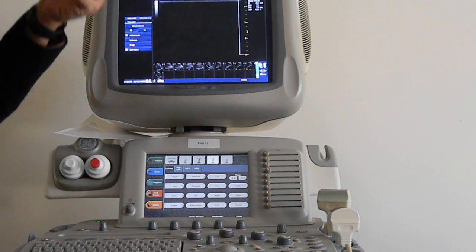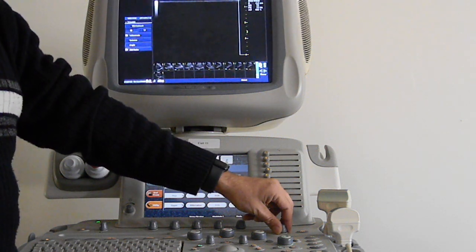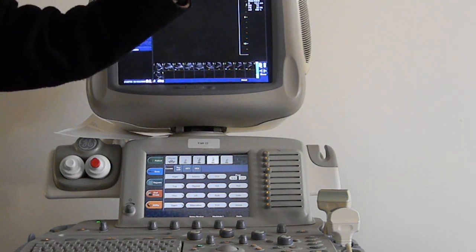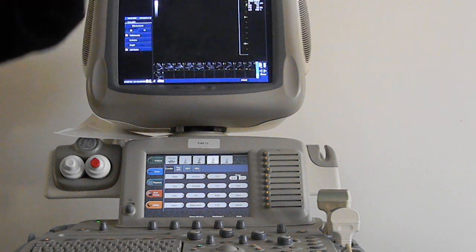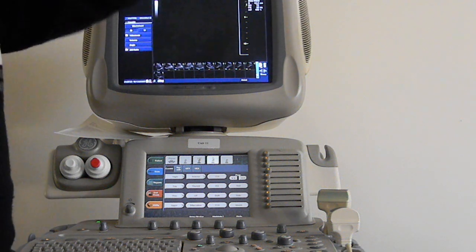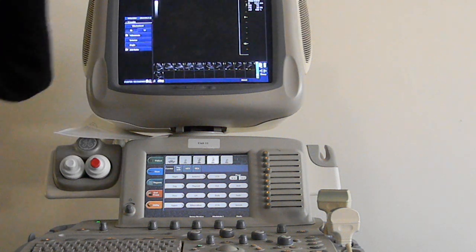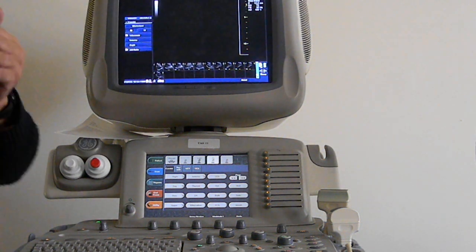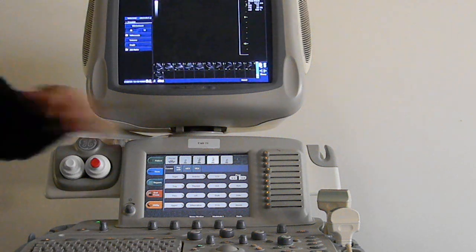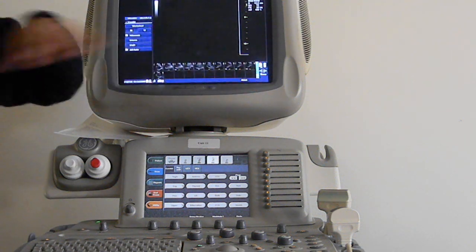Maybe I put on glasses or something, and now I'm actually able to see up to 15 meters. So that's going to be my depth of field. I'll be able to visualize things to a distance of 15 meters, whereas before it was just 4 meters. That would be my depth of field: how far in the field I'm able to see clearly. Does that make sense? So the depth here can also be called the depth of field or depth of view.